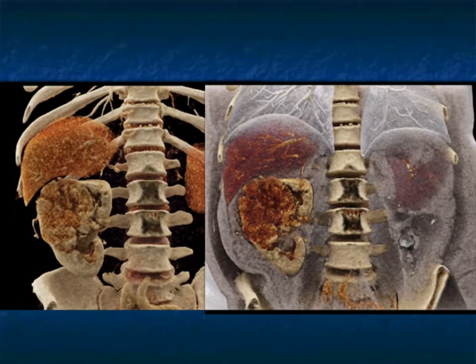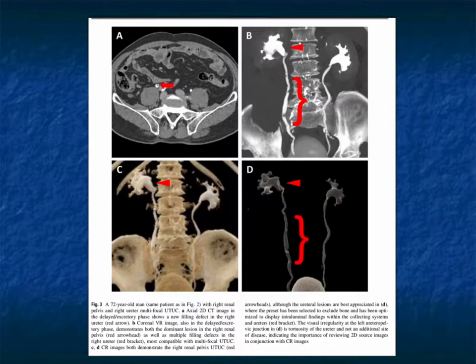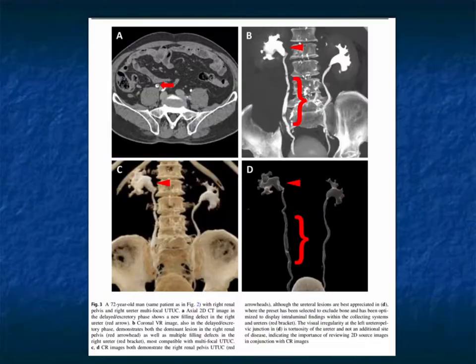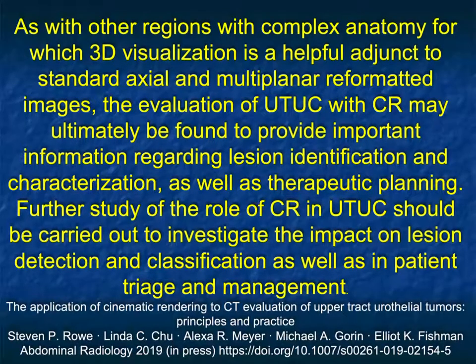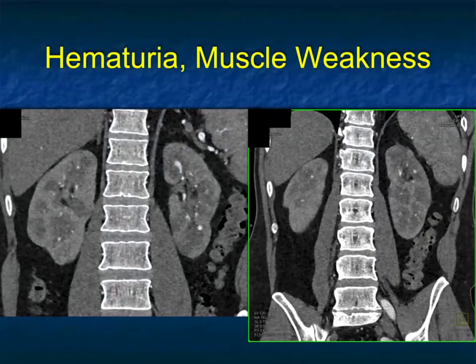Here are a few more different renderings — you can see how we can really accentuate the tumor-normal kidney interface. We've also shown how we can look at transitional cell tumors, the calyces, the ureter — that's in one of our articles and will be coming soon in one of our talks. The use of cinematic rendering for urothelial tumors is very real — the ability to look at the calyces in 3D, the ureter and bladder, all become very valuable.